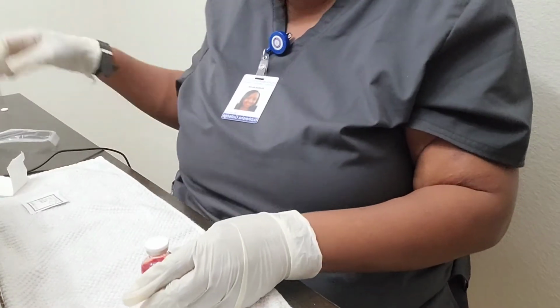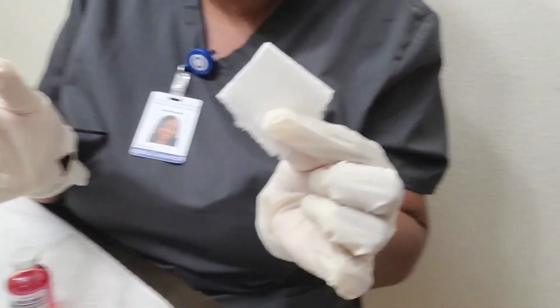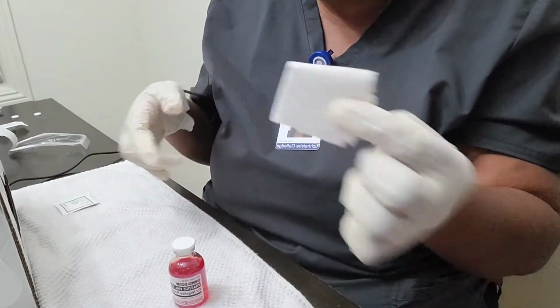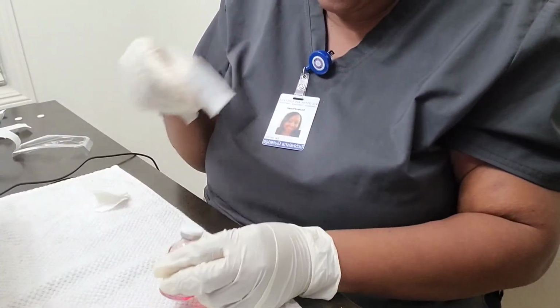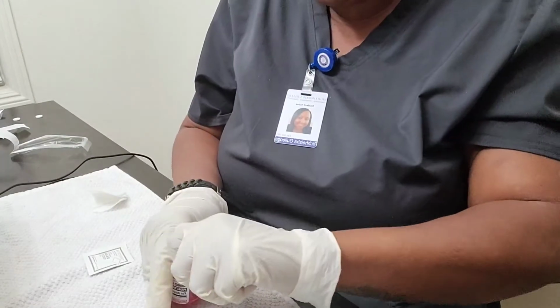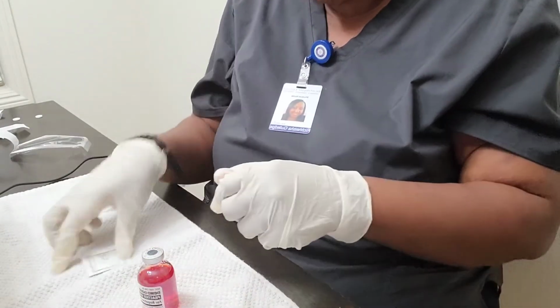Okay. And then I don't have any gauze or anything, but I'm going to use this as my gauze. And then I have an alcohol pad.